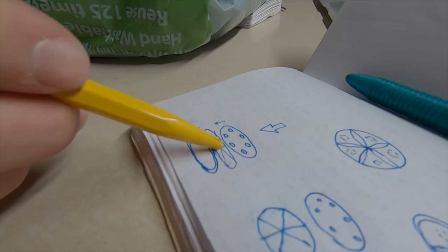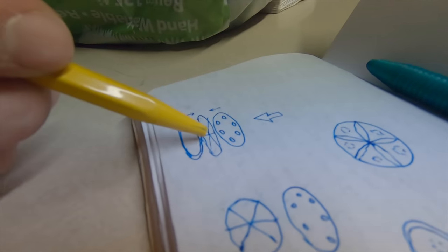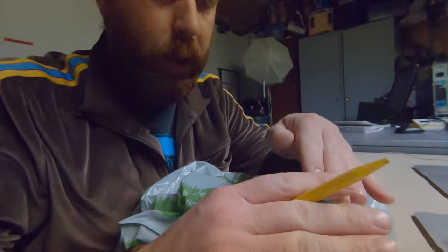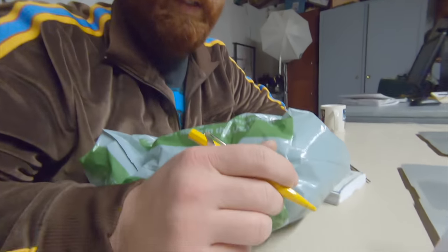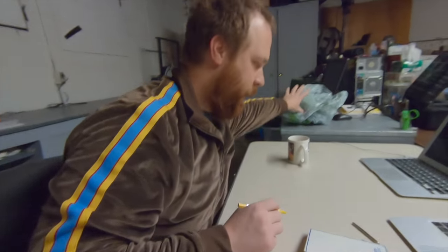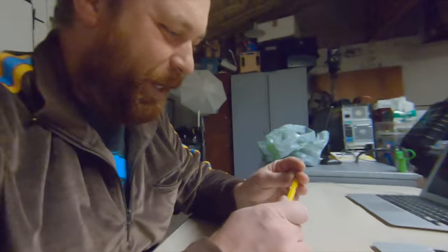And it'll have these slits in it, although they won't go to the entire center. And maybe I will make some sort of brace so that the center is pinned down, right? Because if they curl up like pizza, you noted that they might not come back into the right spot because they're flexible. So let's work on that. The sand dollar valve. Yeah. The sand dollar valve, Joe.